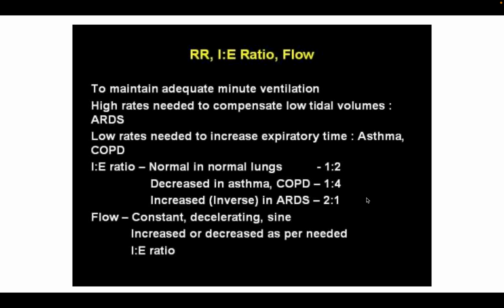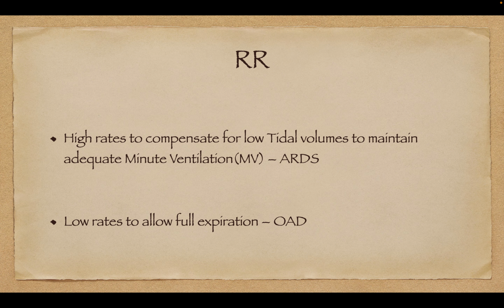Flow, which is constant or sometimes decelerating, as we saw in pressure control modes, can increase or decrease as per the need. And we need to remember that these are another set of knobs which we need to set.